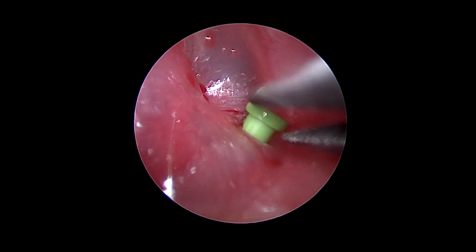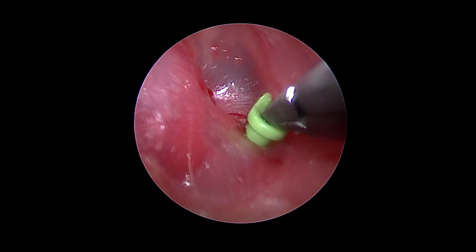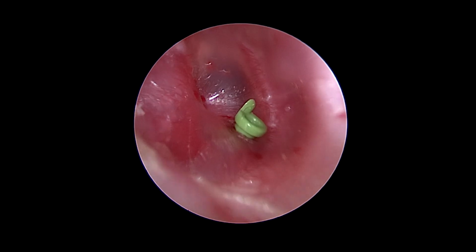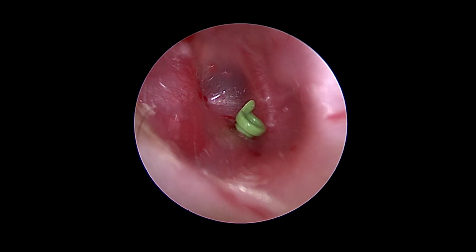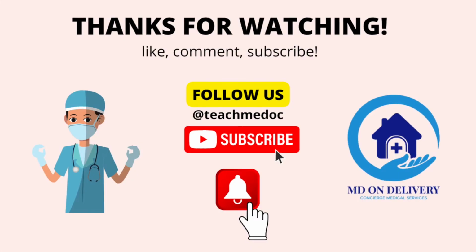So the last step is to put in the ear tube. You can see it has flanges on both sides to keep it in place. This is about a 1.2 to 1.5 millimeter ear tube. The tube will fall out on its own between 6 months and a year. And we're going to put some antibiotic ear drops.